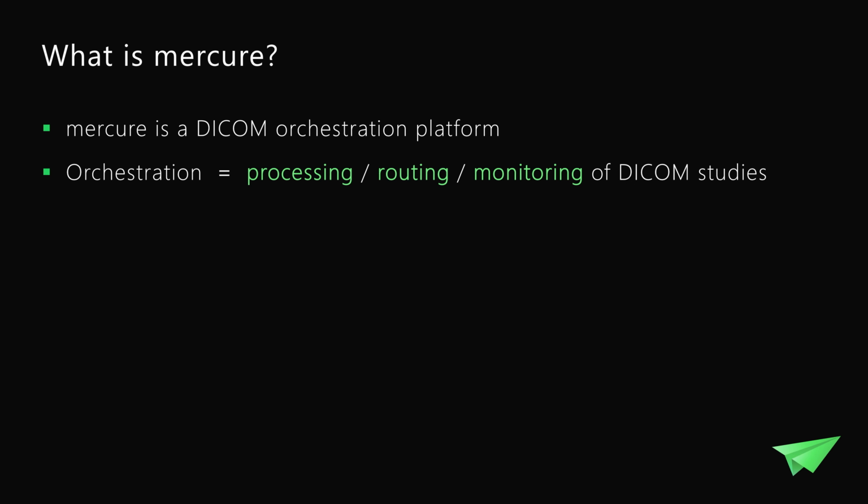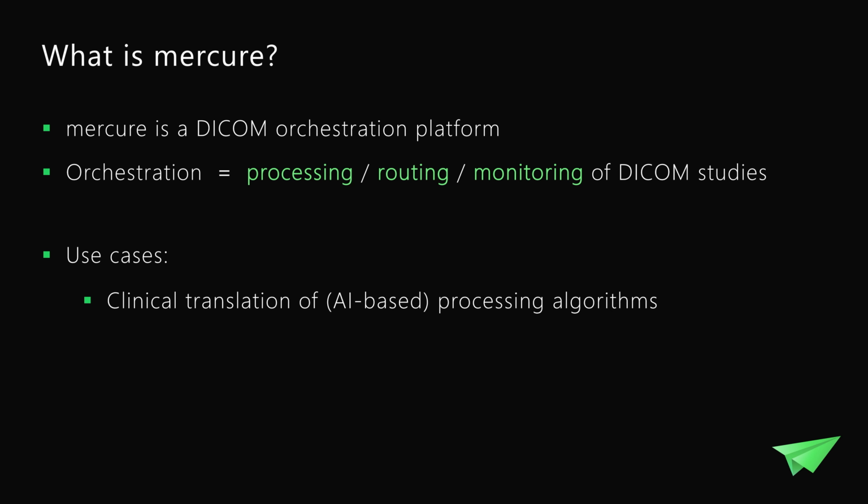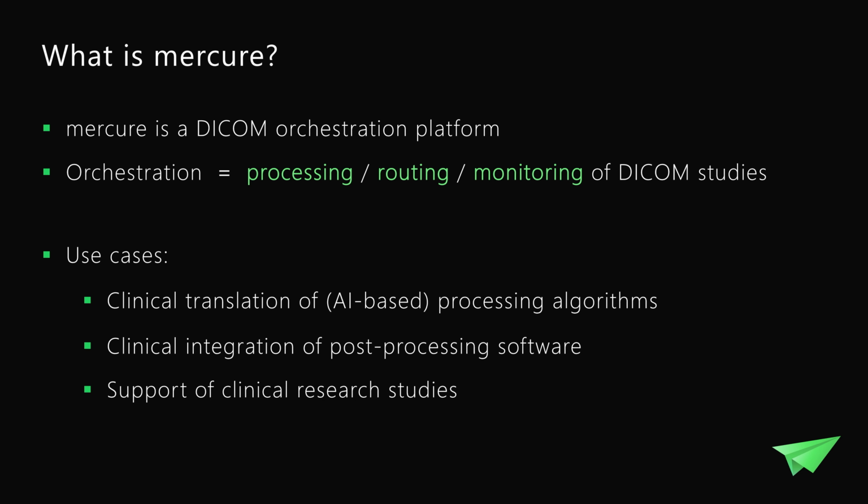So Mercure is a DICOM orchestration platform. And orchestration in this context means processing of DICOM studies, routing of studies, and monitoring of studies. And what you can use it for is, first of all, the clinical translation of image processing algorithms. These can be AI-based algorithms, but you can also integrate any other kind of algorithm. You can also use it for the clinical integration of different post-processing tools. It can be very useful for supporting clinical research studies, and there are many other possible applications.